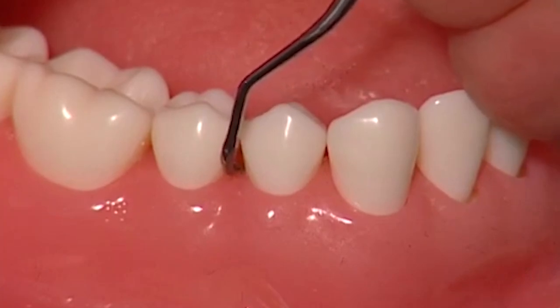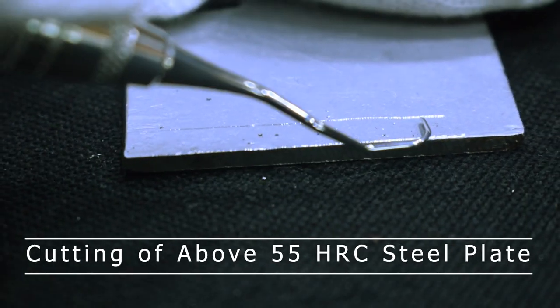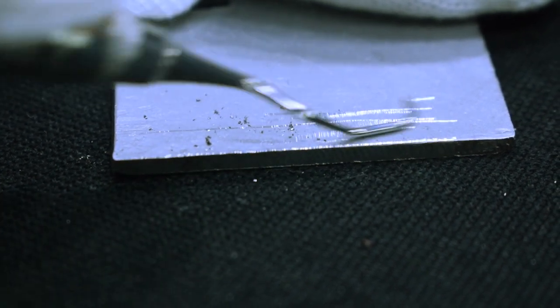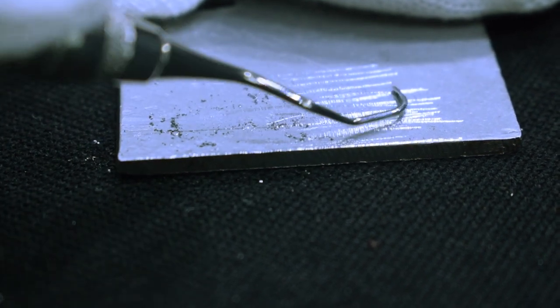They feature precise tip shapes and wear-resistant properties, allowing for efficient calculus removal in hard-to-reach areas. The 70-degree angled face and dual cutting edges enable precise and gentle subgingival calculus and plaque removal without causing harm to the gingival tissue.